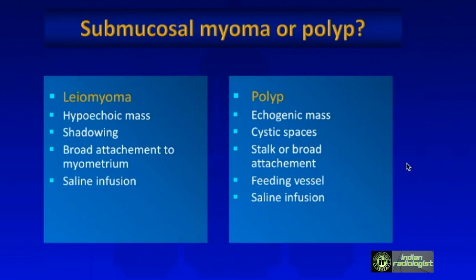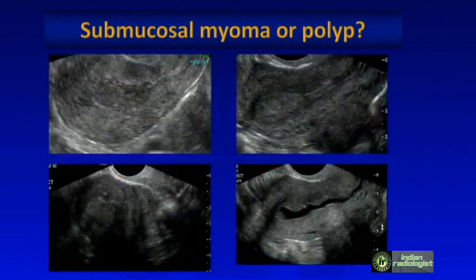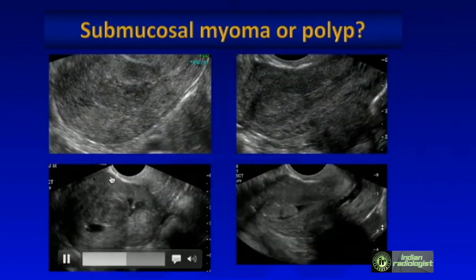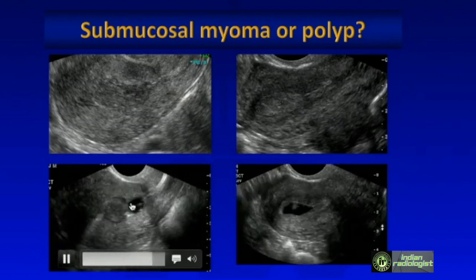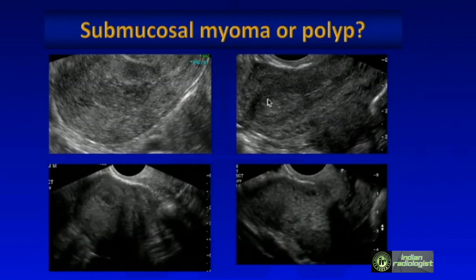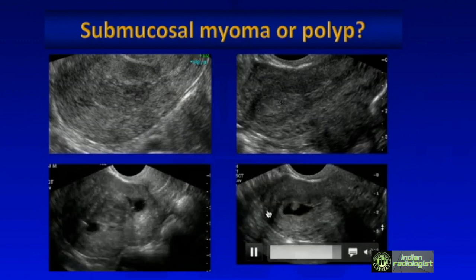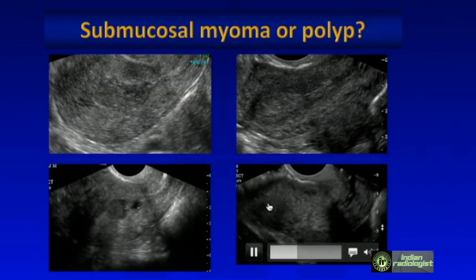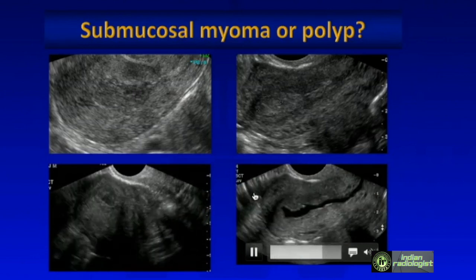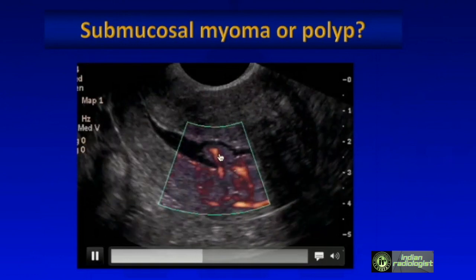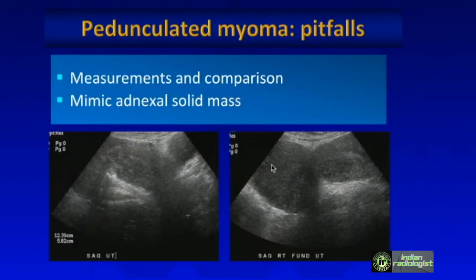The other dilemma: is that a submucosal myoma or a polyp? Myomas tend to be hypoechoic, may have shadowing, and tend to have a broad attachment to the uterus. Endometrial polyps tend to be more echogenic, may have cystic spaces, can have a stalk or broad attachment, and often have a feeding vessel. Saline infusion sonography is very helpful. Here a submucosal leiomyoma has a broad attachment and is hypoechoic with shadowing, versus a polyp with a narrow attachment, cystic spaces, and a feeding vessel on color Doppler.